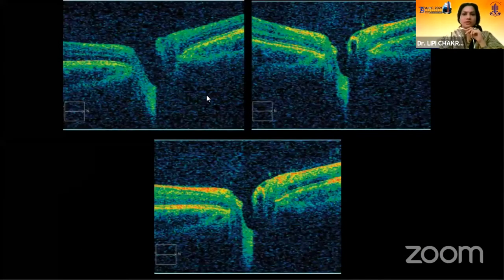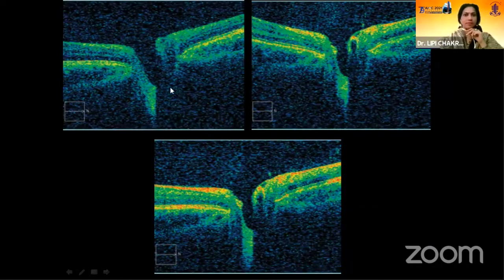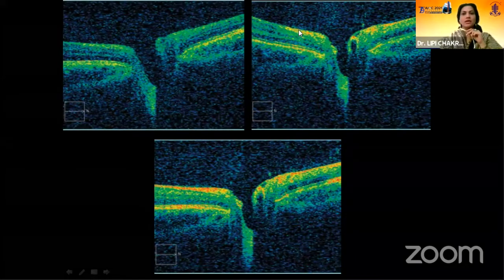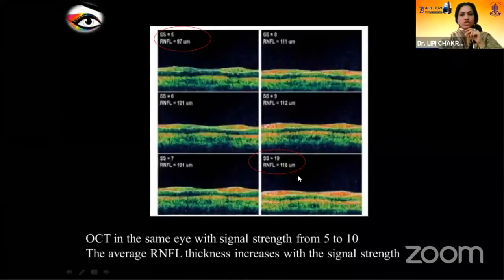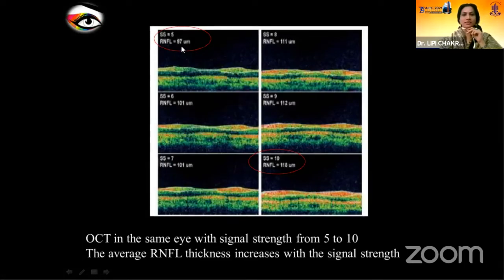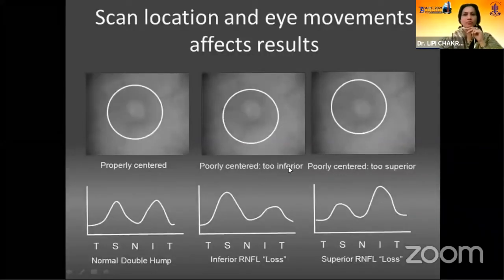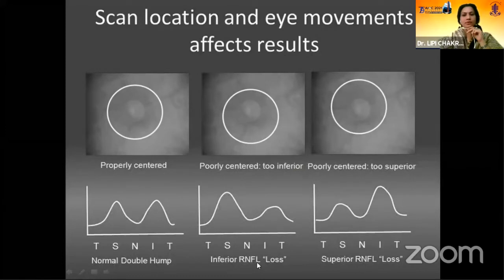Here is one interesting example of a myopic disc of the same patient. The patient's forehead was a little away from the headband or there was a head tilt, so we are getting no RNFL in one part, then it starts appearing, and then appears correctly. We need correct positioning of the patient. Regarding signal strength, increasing from 5 to 10 gives RNFL thickness increase from 97 microns to 118 microns. Scan location also matters — if the circle is too inferior, we get apparent inferior or superior RNFL loss.